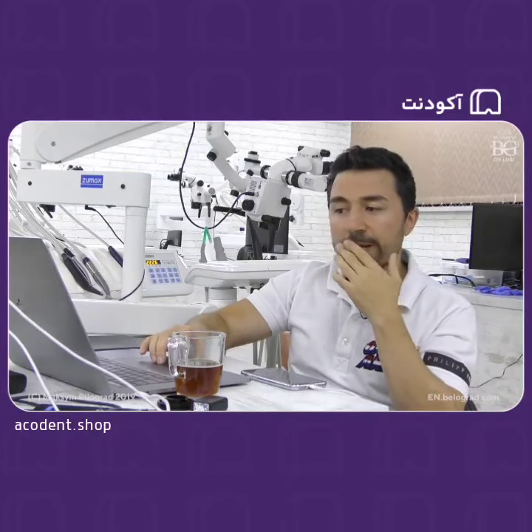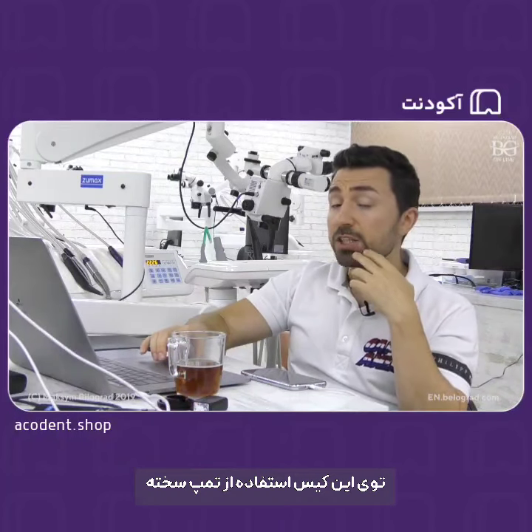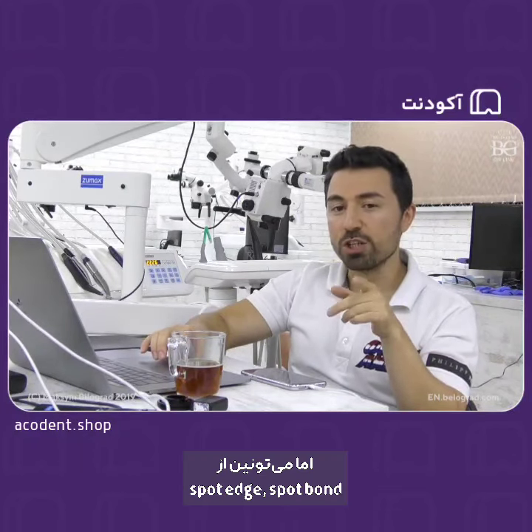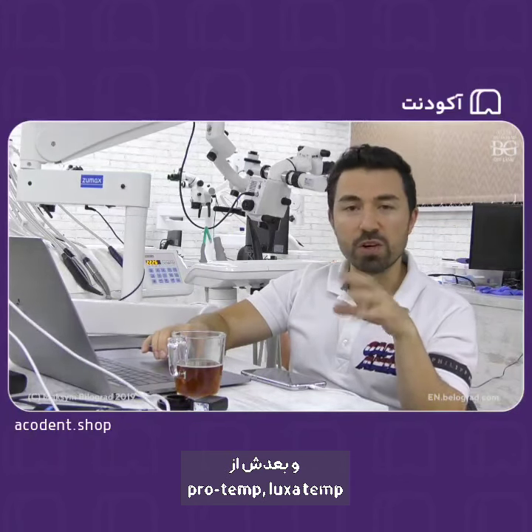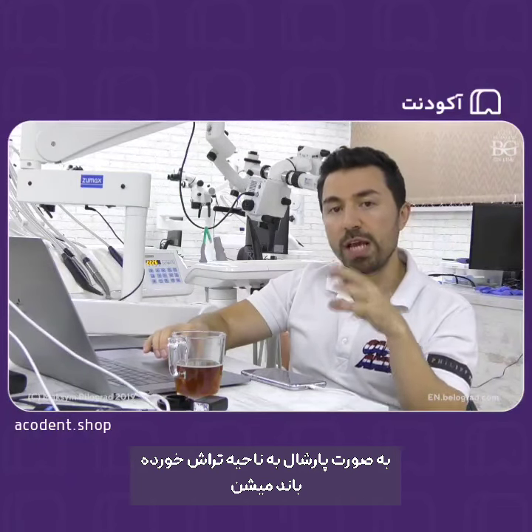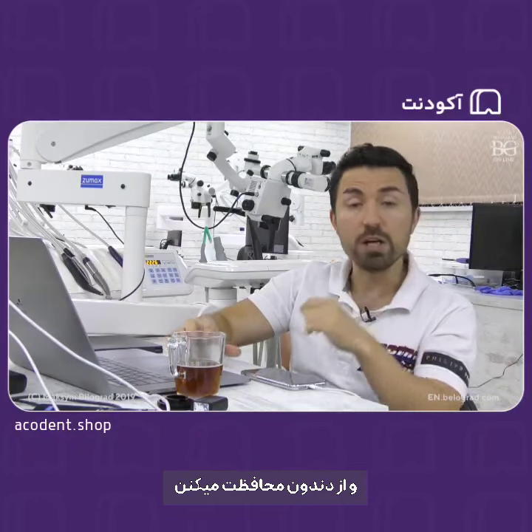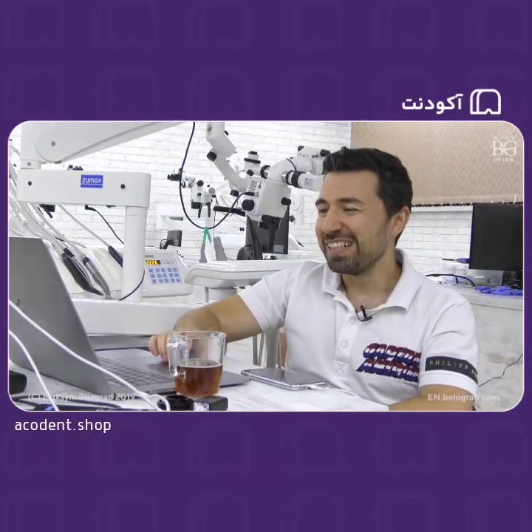Okay, good. Another question, how would you temporize this case? In this case, it's pretty difficult to temporize, but the tip is you can do spot etch, spot bond, and then you do this Pro Temp or Luxa Temp or whatever, or bisacryl material, and it will be partially bonded to the areas that you have prepared before. So they will be partially bonded and they will be secured on the tooth surface. But it's not that easy, you are right.